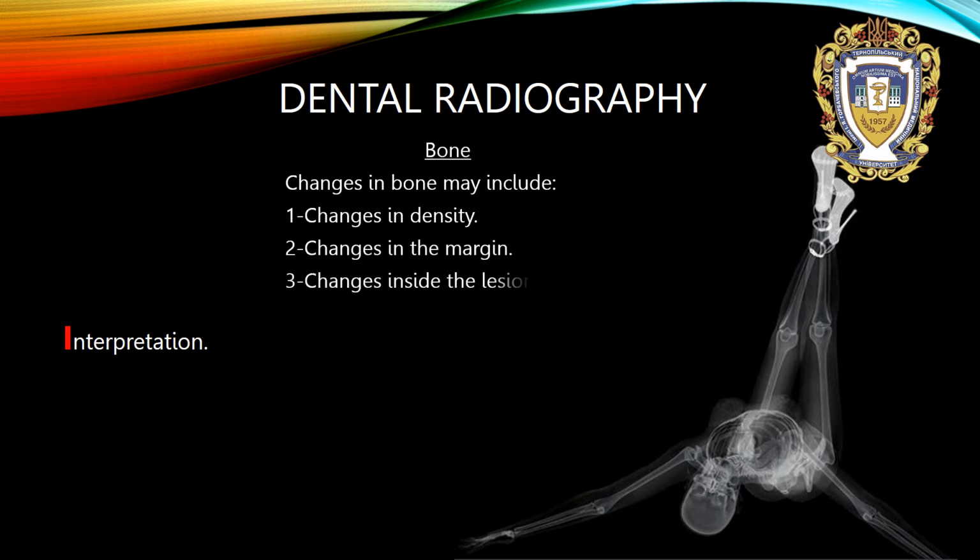Bone: changes in bone may include changes in density, changes in the margin, changes inside the lesion, effect on surrounding tissues, changes in structure.